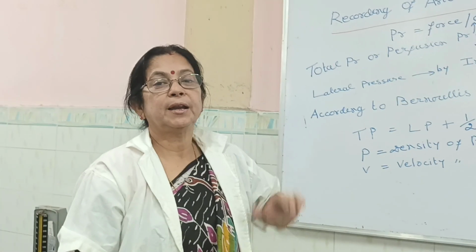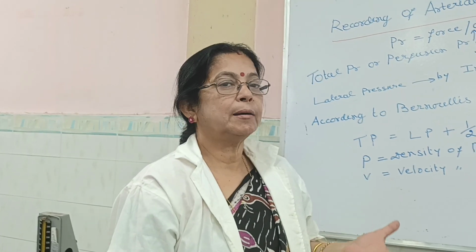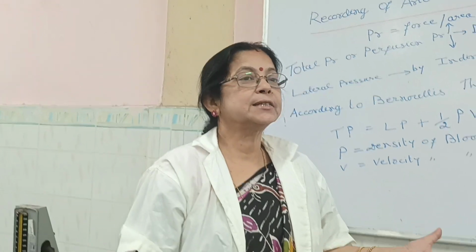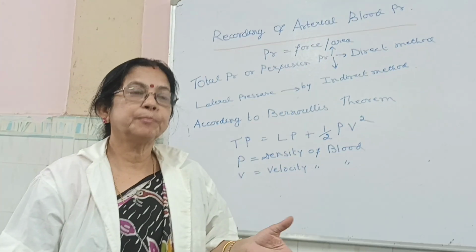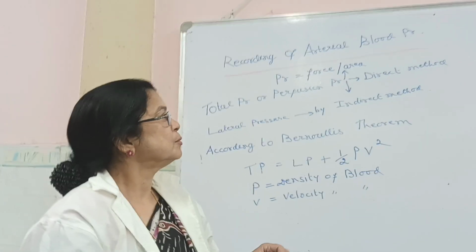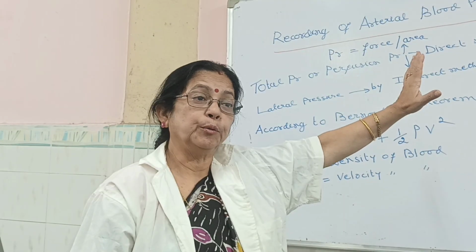Recording of arterial blood pressure. Now, arterial blood pressure, all of you know how to measure arterial blood pressure. All the clinicians, the paramedical staff, nursing staff, even patients at home, have purchased a blood pressure machine. So all of them are measuring arterial blood pressure at home.